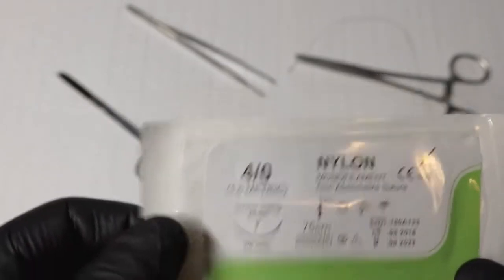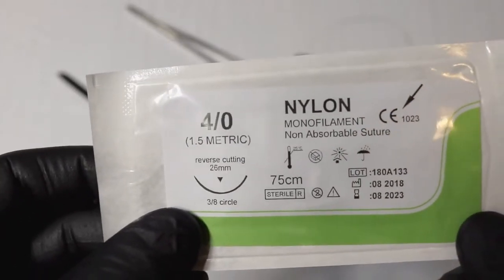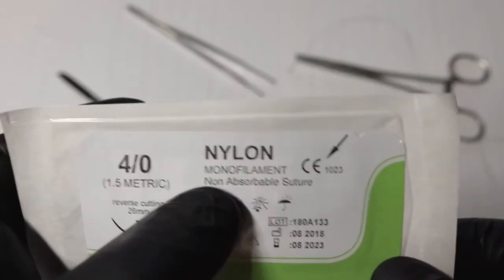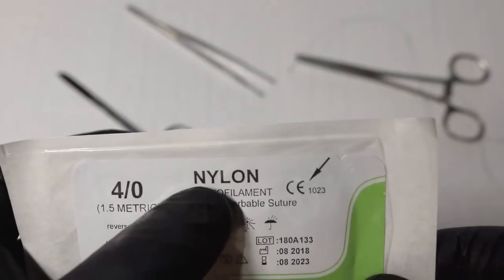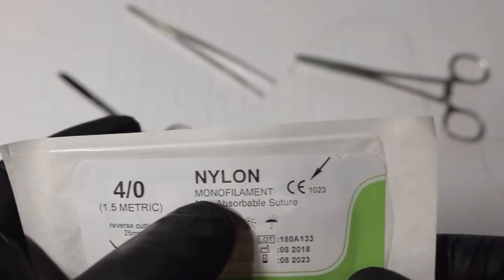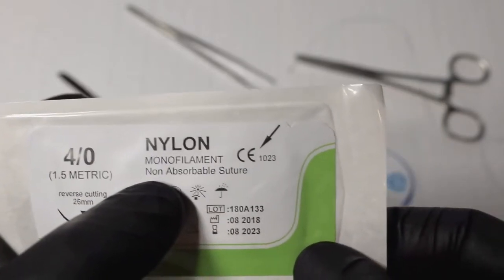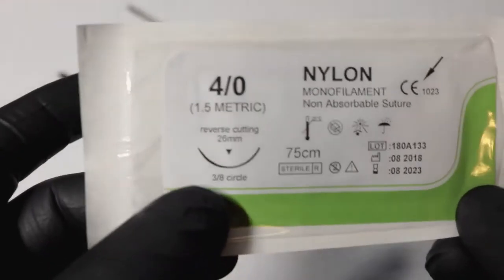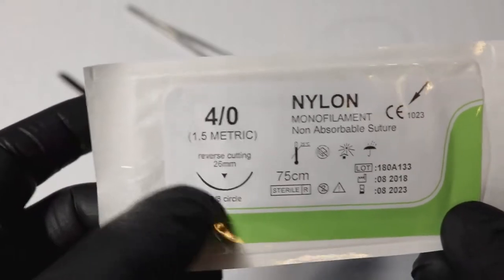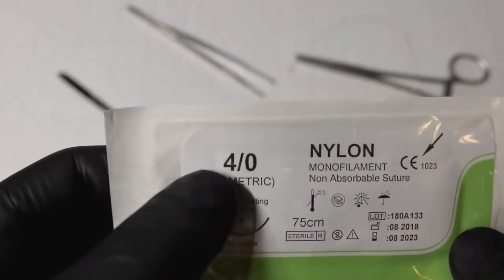A cutting needle is pretty much all you're going to see anyway. Here we have monofilament — you can see on the packaging that nylon is the type of thread. You can also have silk and others. It's a monofilament, so it's non-braided and non-absorbable. The packaging also tells you it's three-eighths of a circle and 26 millimeters in length — extra details you don't need to focus on too much.